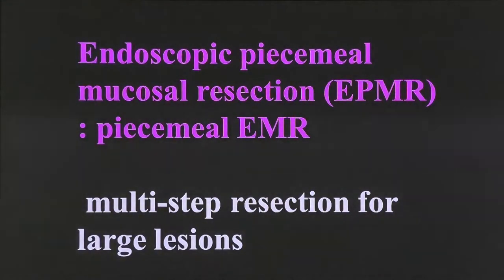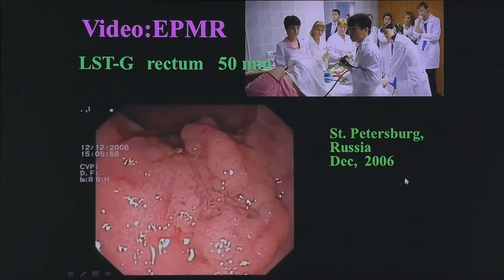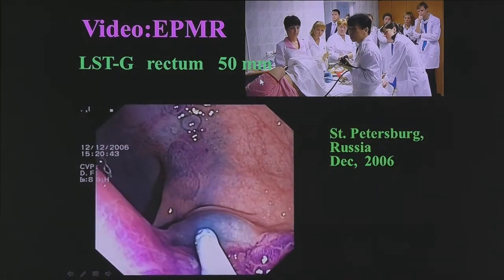Now I'm going to talk about piecemeal EMR. For larger lesions, piecemeal EMR is required. It was done in St. Petersburg many years ago. The lesion was 50 millimeters in diameter.